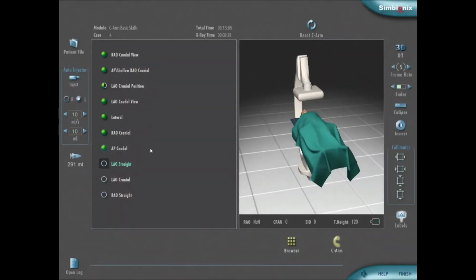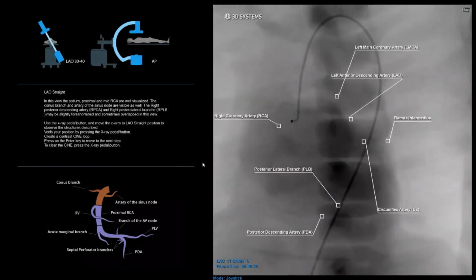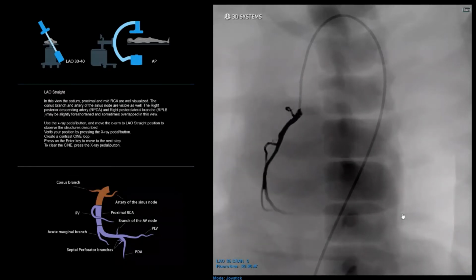So moving on to some right coronary views now. So we'll start with what we call the plain LAO. So let's get to LAO 30 to 40. That's beautiful. And as Shani was moving the screen, you saw that spine went towards the right of the screen. So we know this is an LAO, and we are not cranial or caudal.